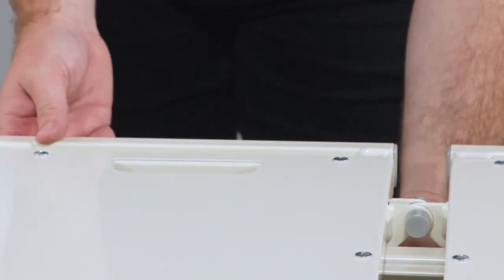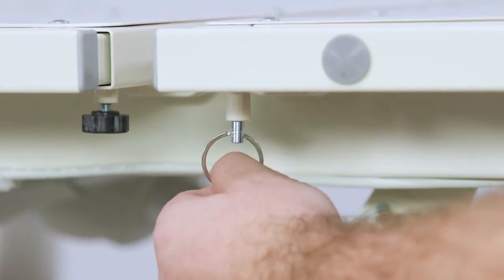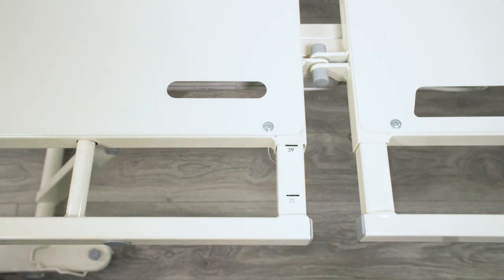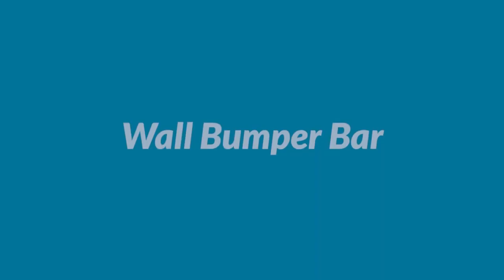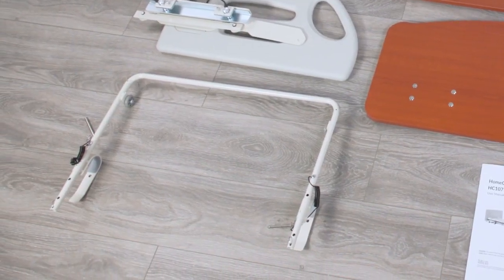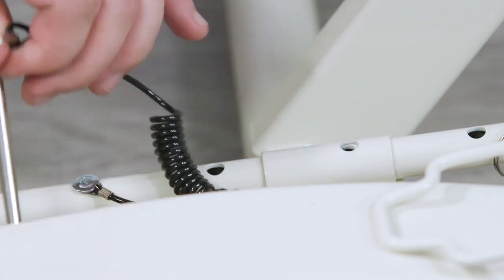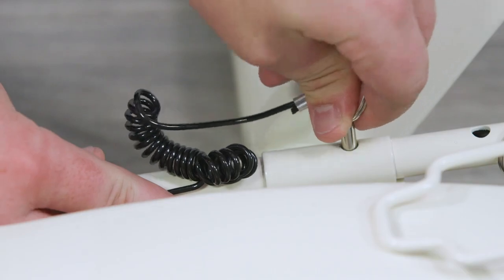To adjust the bed width, loosen the locking knob and pull the expansion pin. Move the expansion bar in or out as desired to match the mattress retainers. Release the knob once the bar is set at the appropriate width and tighten the locking knob. Now the wall bumper can be installed. Clip the wall bumper bar at the head end of the bed. Make sure the bumper bar foot stand is facing the floor. Insert the locking pins in the holes in each side appropriate for the length of mattress you are using.